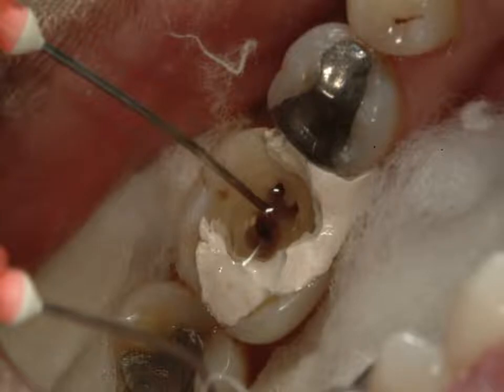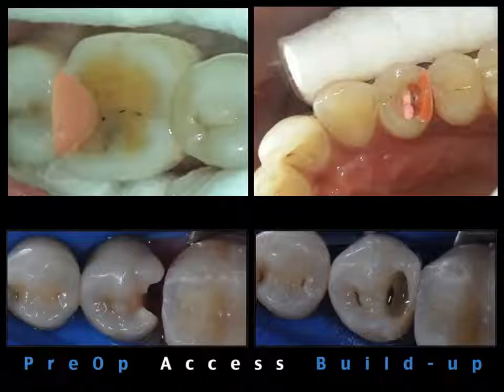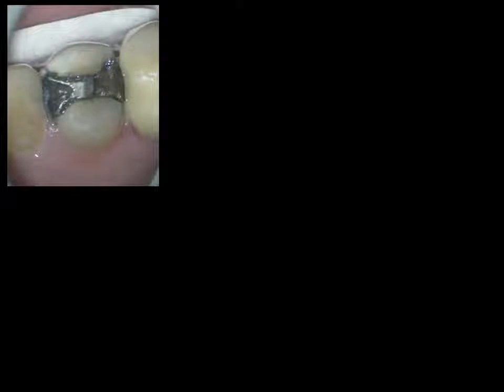Isolating the cavity with cotton is not sufficient. What we can do is, before we start a root canal treatment, we should first close the cavities so that we have a four-walled chamber wherein sodium hypochlorite can be easily stored and act like a reservoir. This also prevents all the exit points, barring the occlusal cavity, where we can use suction actively to tackle leaching sodium hypochlorite.